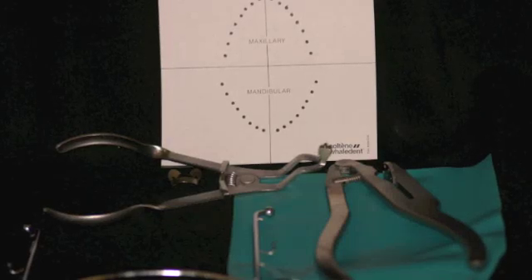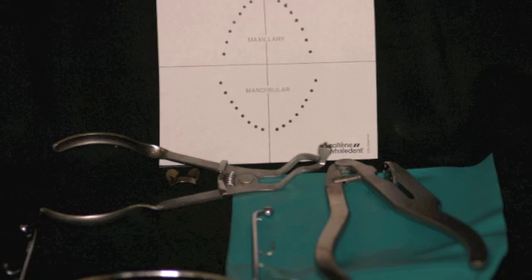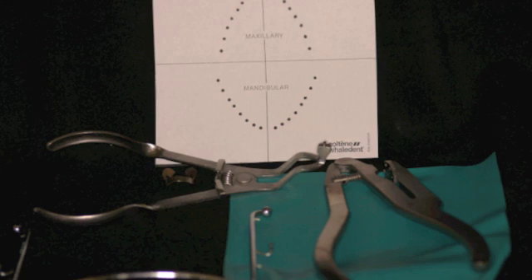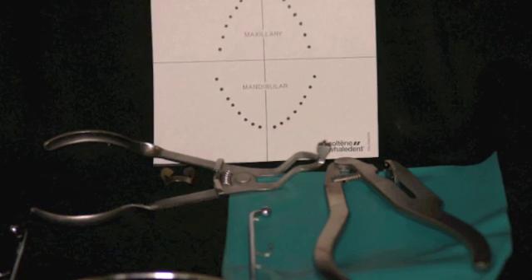Our armamentarium includes rubber dam, rubber dam frame, template, rubber dam punch, rubber dam forceps, and a rubber dam clamp.